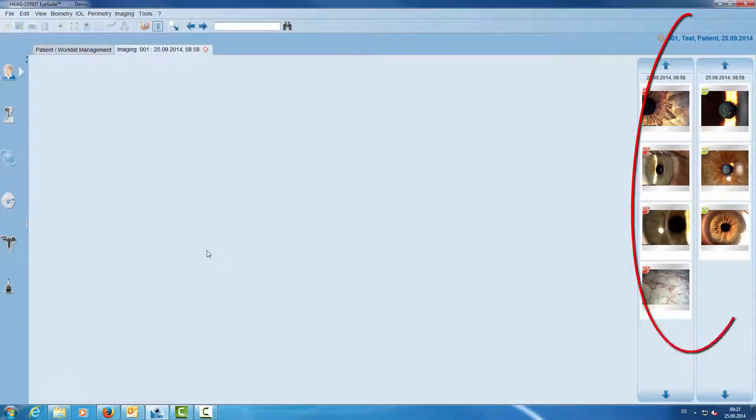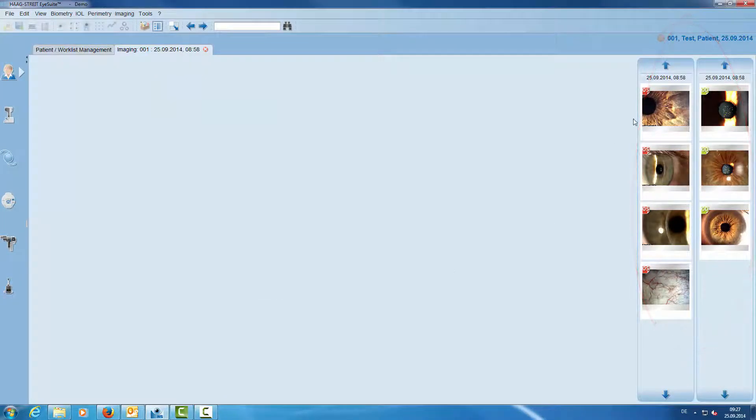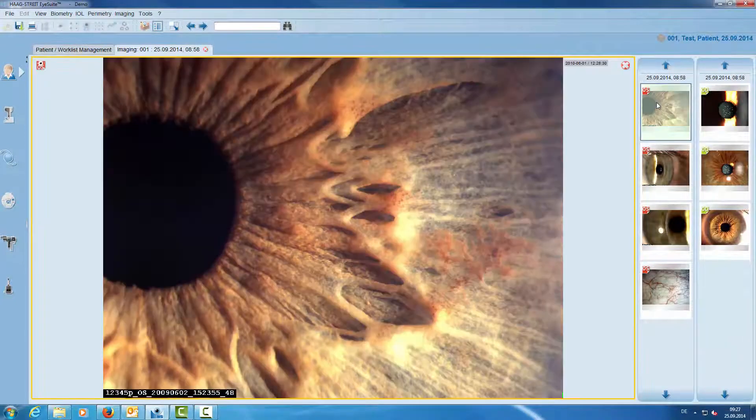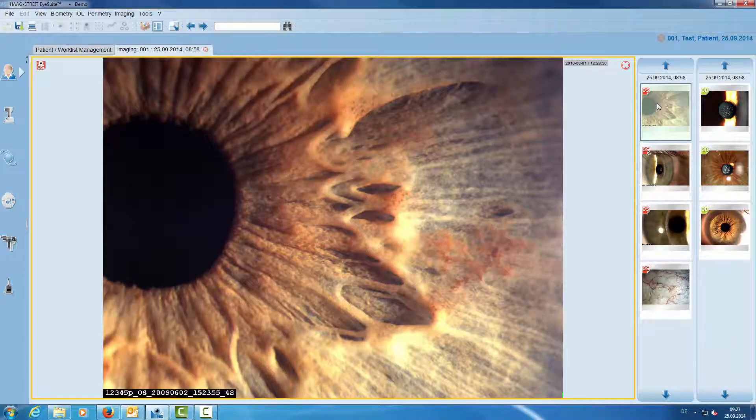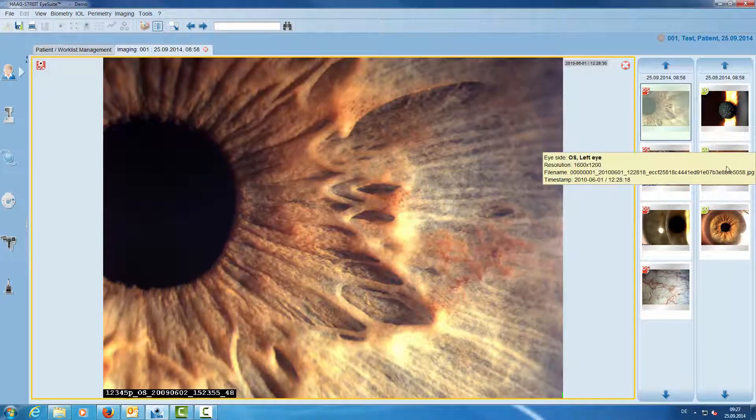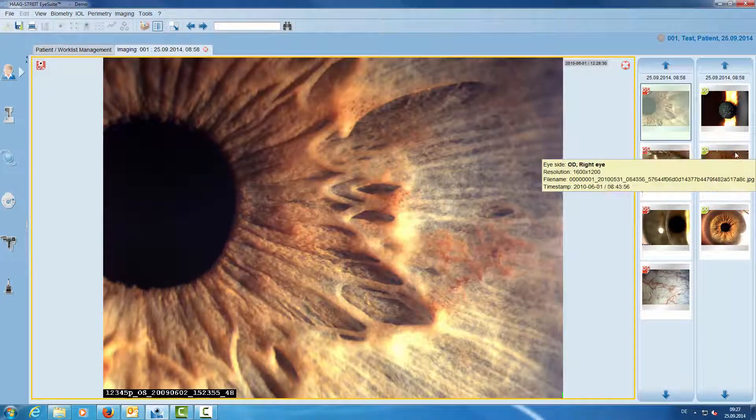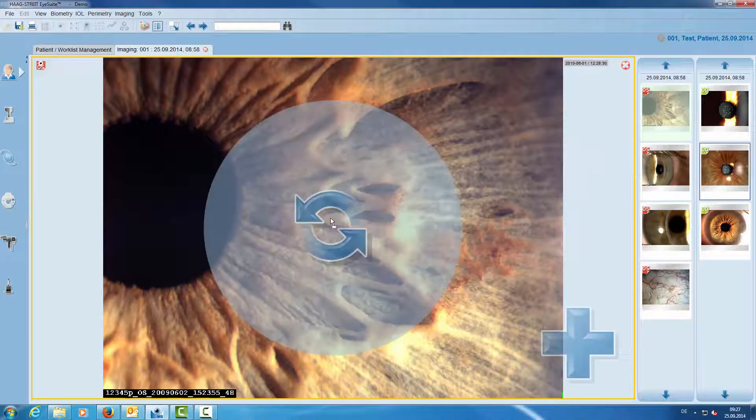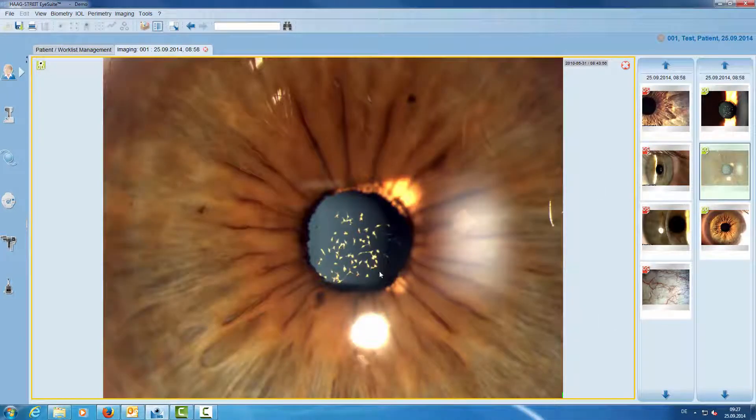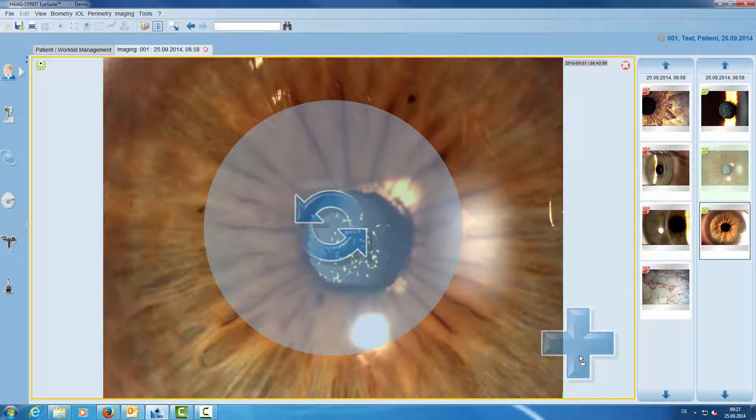On the right side we have the thumbnails of the images of the left and the right eye. We open an image with a double click. This also works with drag and drop. We can further add images.